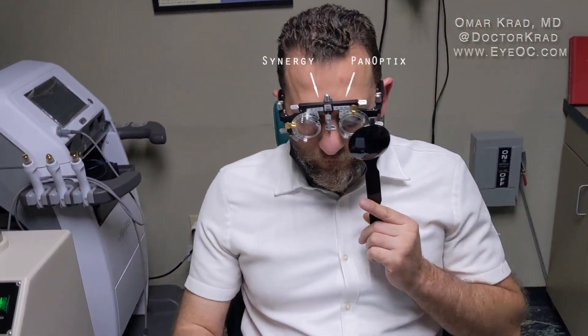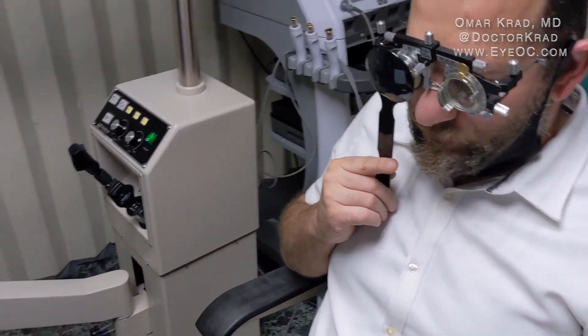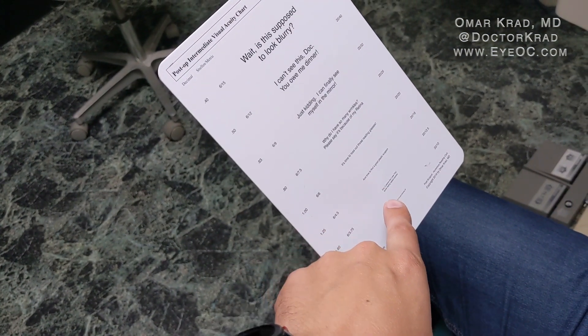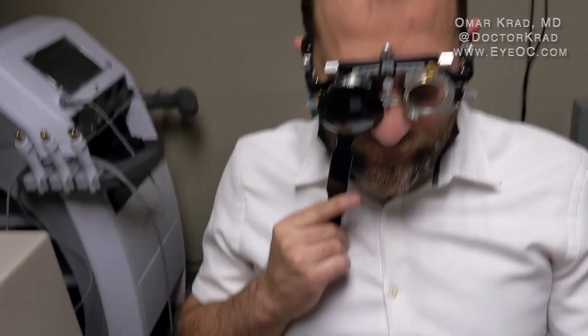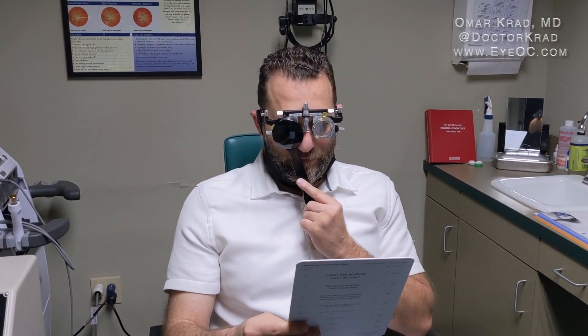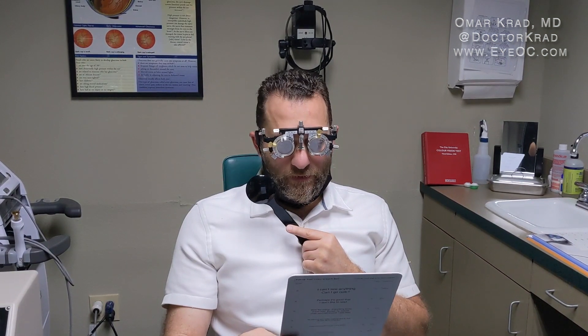A near vision reading card is given. Covering each eye and comparing a specific line of text, the patient says the left PanOptix eye is still better for near vision. So the summary so far: distance vision is better with the Synergy right eye, near vision is preferred with the PanOptix left eye, and nighttime headlight vision is also better with the PanOptix.